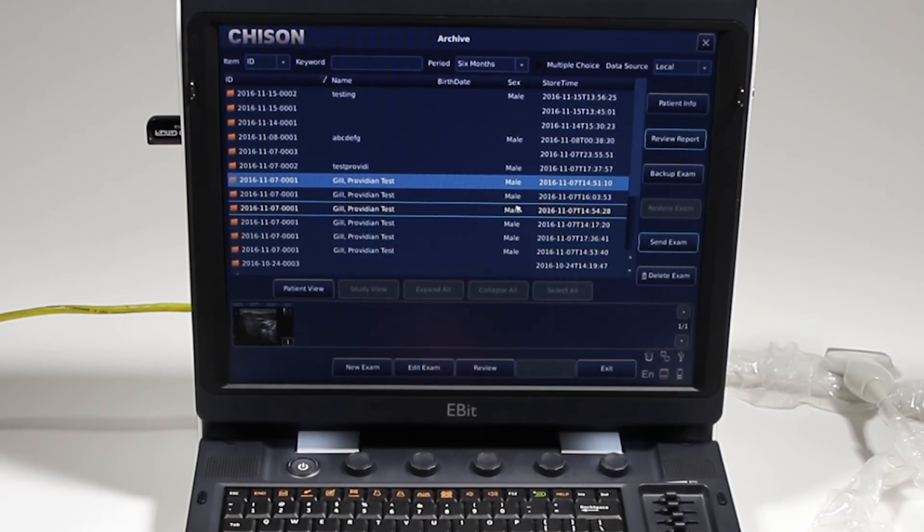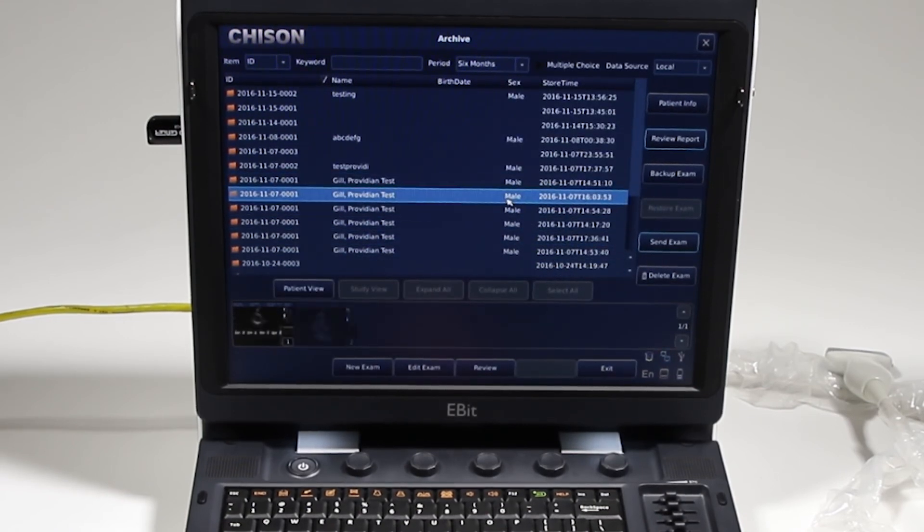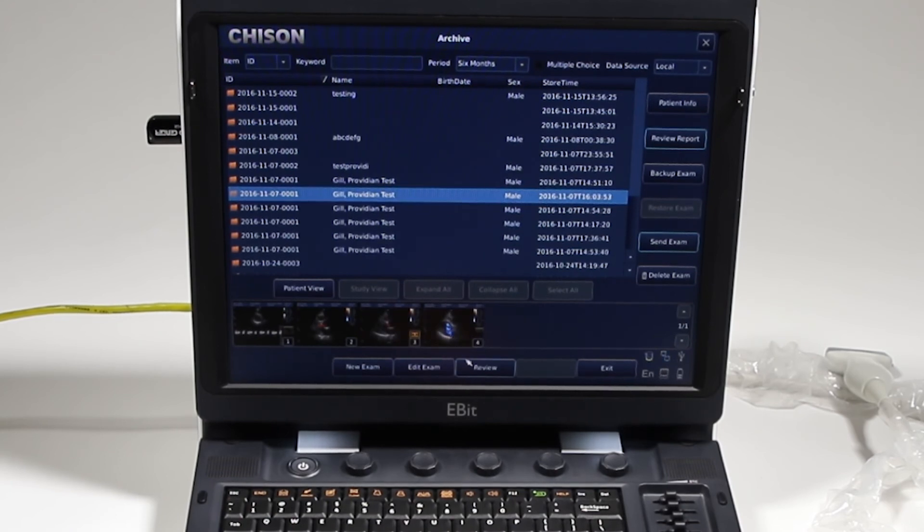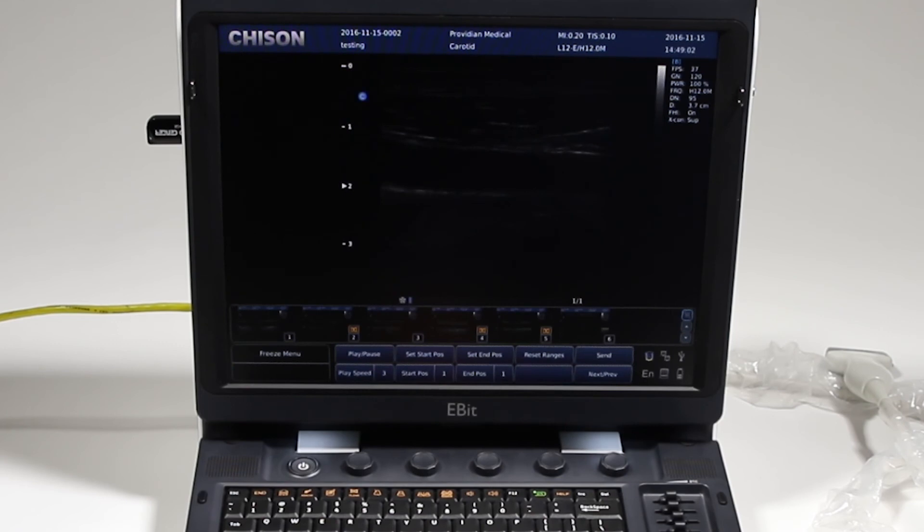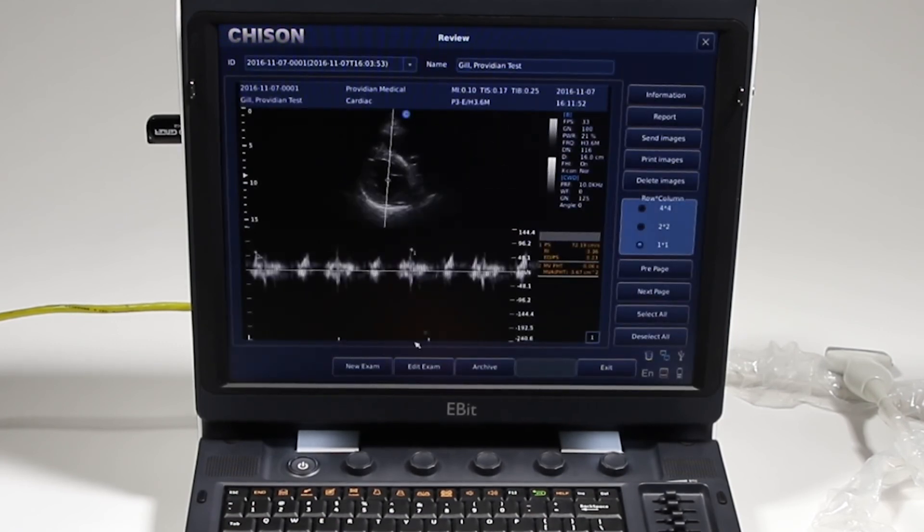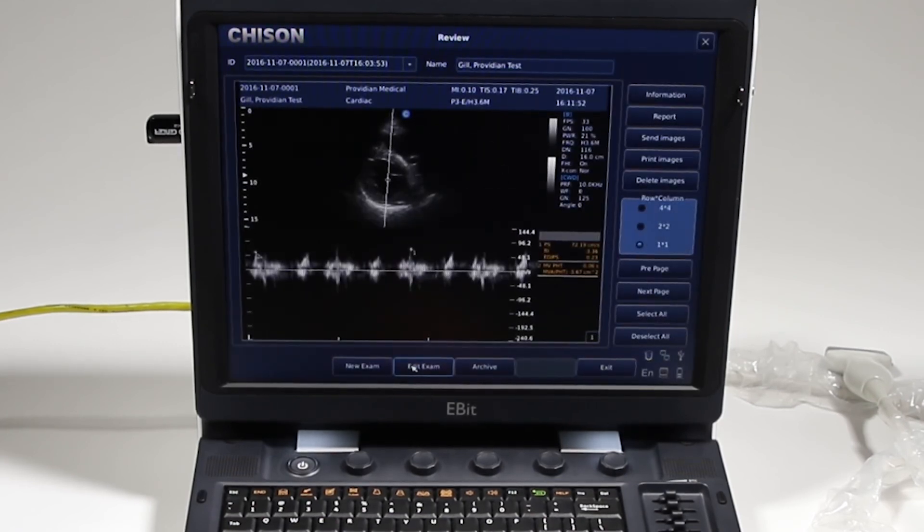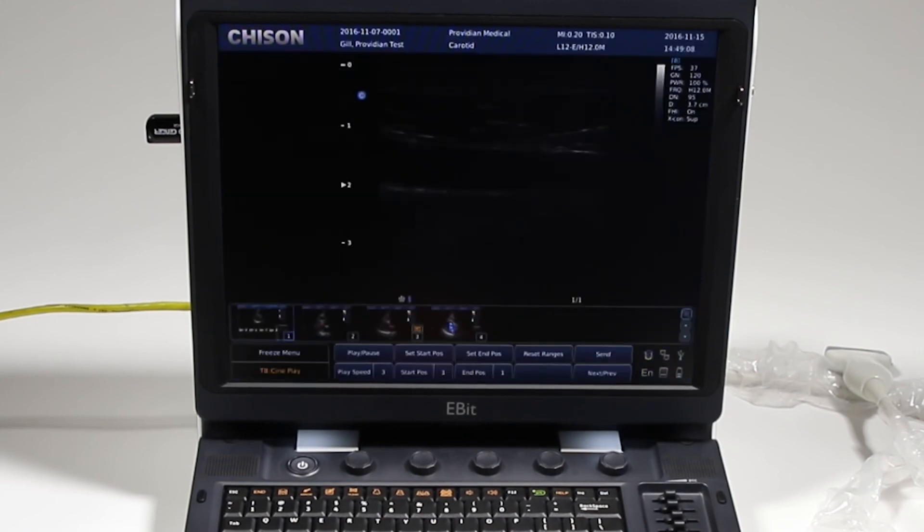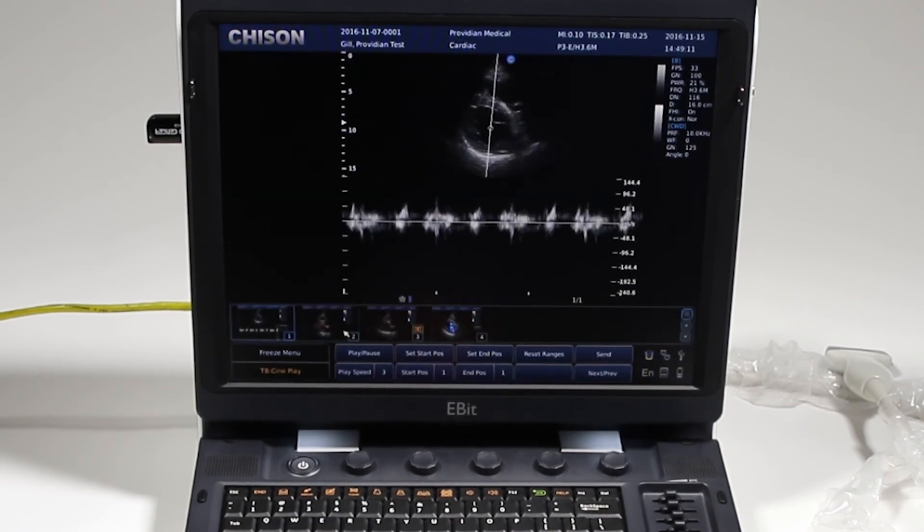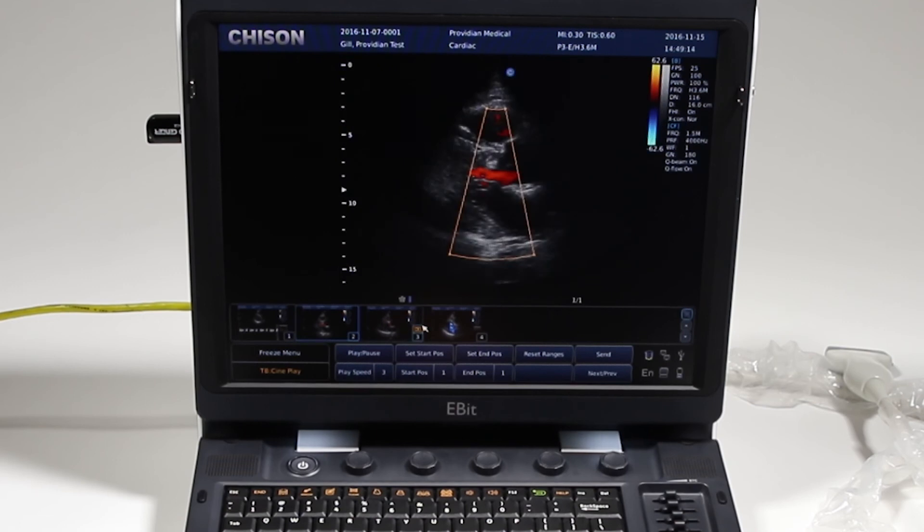Also, from this screen, we can not just view the thumbnails of that previous exam. We can go ahead and click review, and from here, it opens that patient back up. I can edit the exam, and here I can take a look at those images in full screen again.